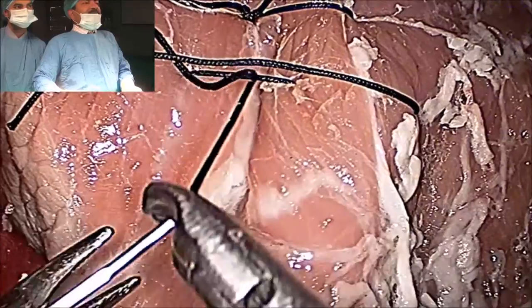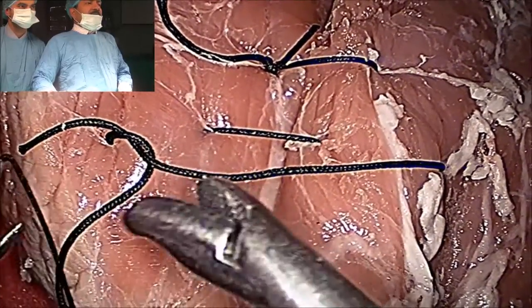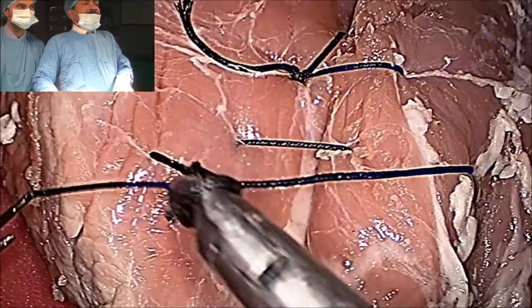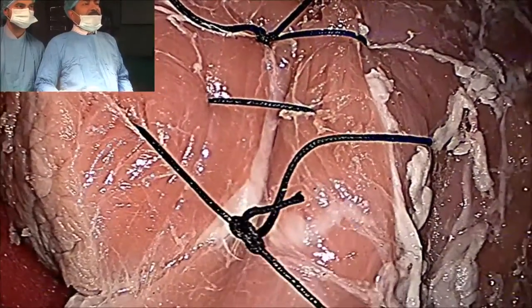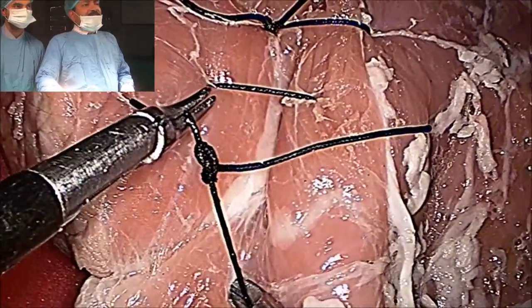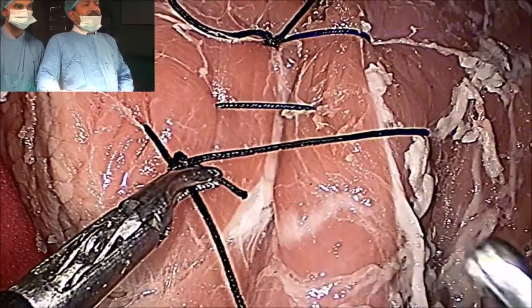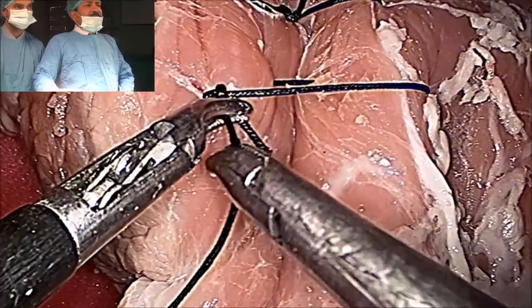After that you will take the another half — this is another half of the square knot that has to be taken. Remember, whenever you take the knot, ideally the needle should not be used to hold — you hold the tail. But take care that when it is a square, the needle hand has to be pulled, and this is called tumbling. You will hold the needle end and straighten it — this is called tumbling. After tumbling, the knot is ready to slide. Just hold it by the tip and slowly you will slide it. This is sliding now, and slowly you can pull the tissue as much as you want.